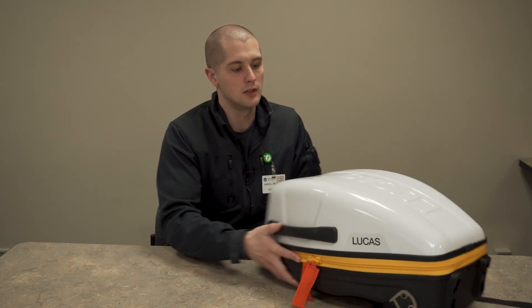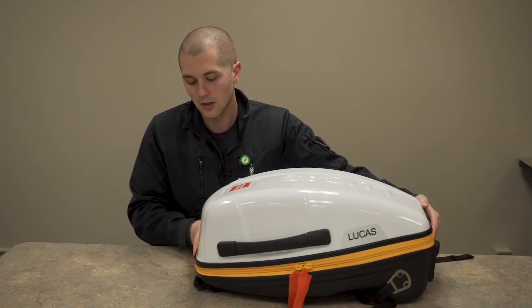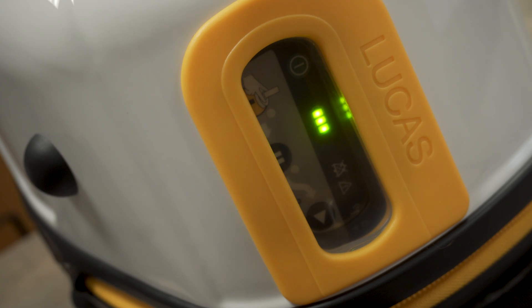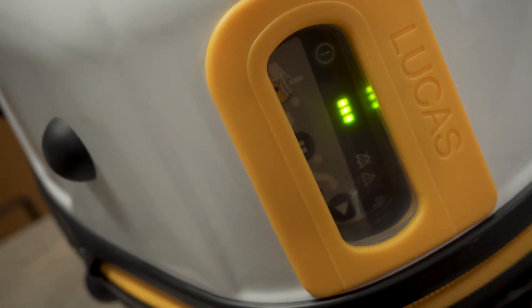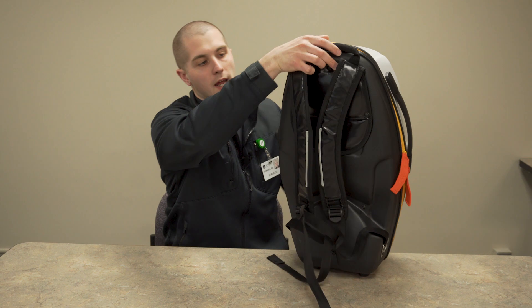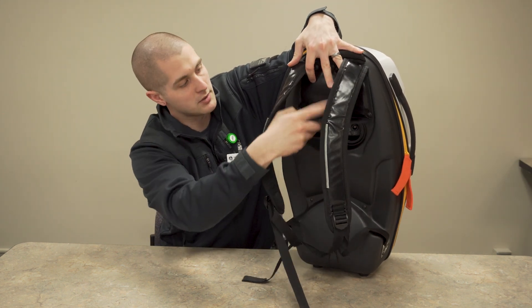The case on the Lucas 3 is a hard shell case. You have a couple of great features on it. Number one, you have a clear plastic bubble here where you can actually check the battery indicator. You can also turn it on prior to going into a building or somewhere where cardiac arrest has occurred to get you ready. On the back, it has a battery port that you can access, and it can be plugged in while it's on your ambulance.